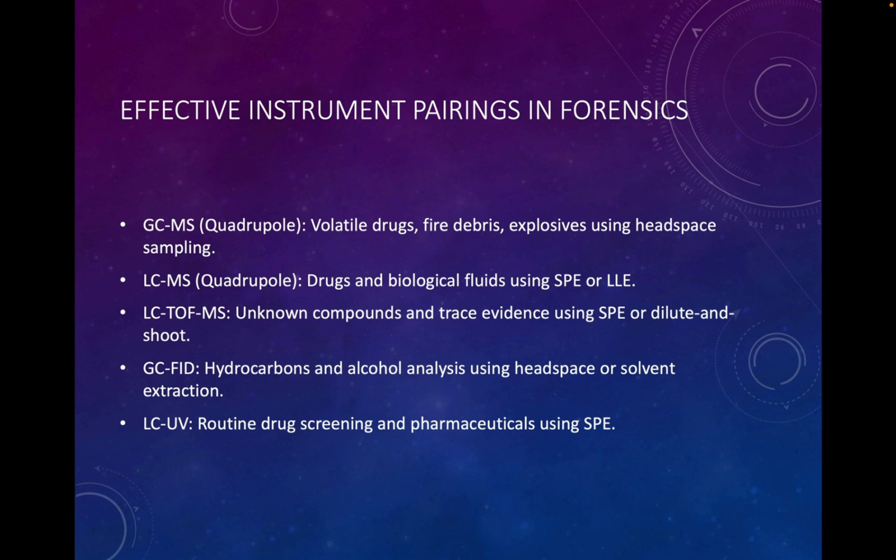Gas chromatography FID is ideal for hydrocarbons and alcohol analysis, while liquid chromatography UV is commonly used for routine drug screening and pharmaceutical analysis. From my perspective, having versatile systems that can handle multiple case types is one of the smartest investments any lab can make.